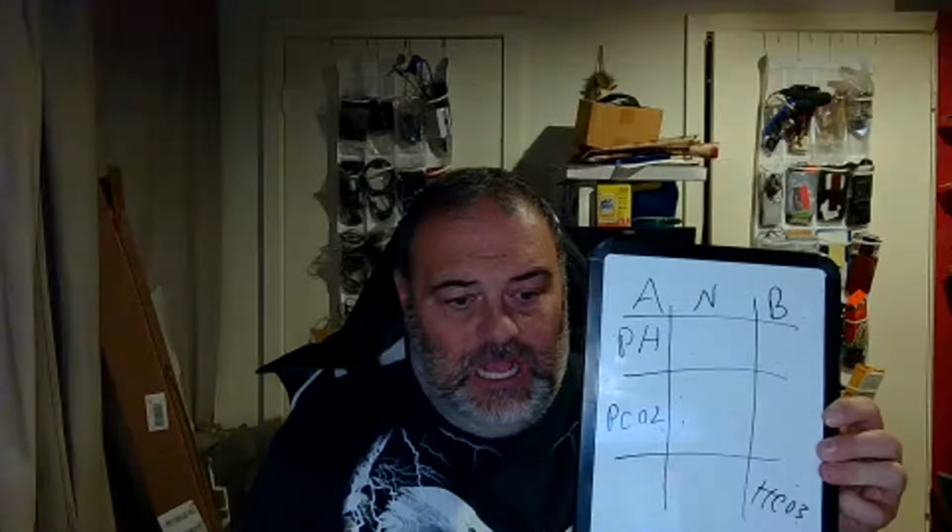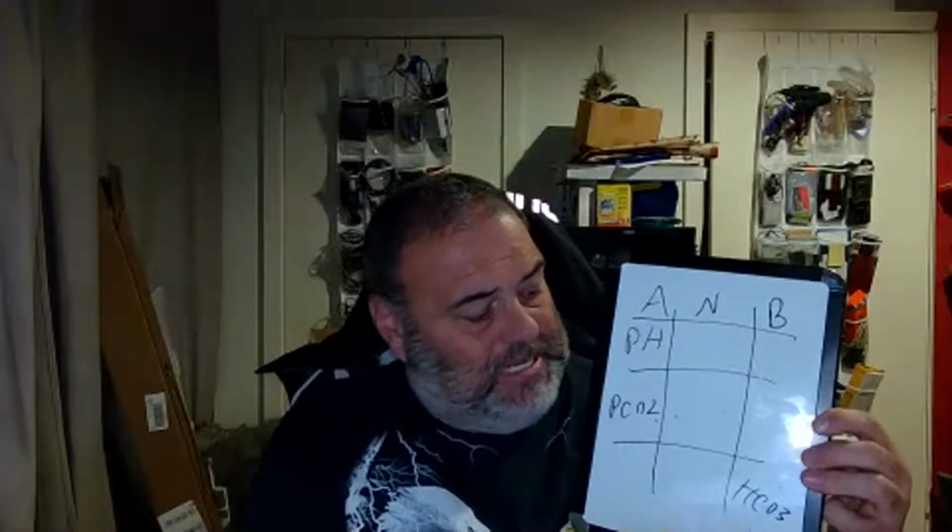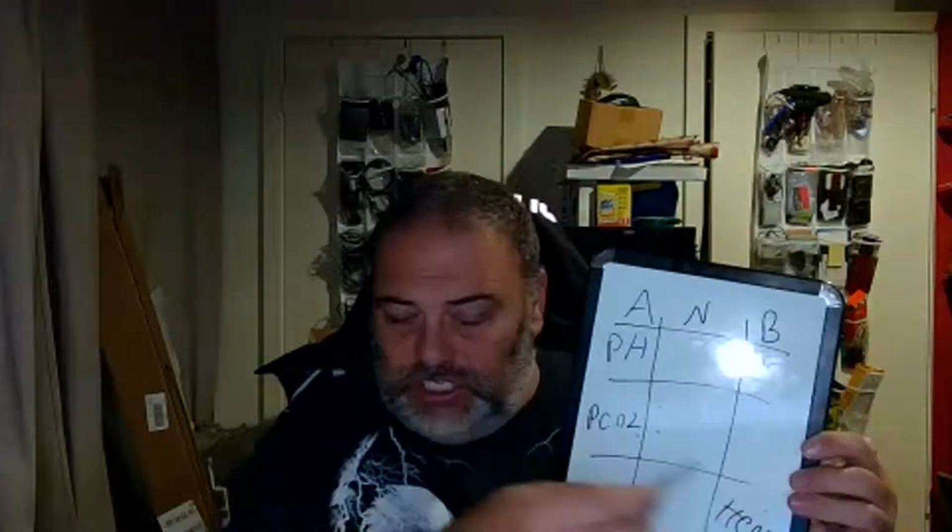And we can see with our bicarb way over here that it's partially compensated. It's being compensated. So the body's trying to fix it. So partially compensated respiratory acidosis. You just read the chart. Write your 3 components down, read the chart. Practice it, and you'll get to where, if you're putting the components in the right place, you won't misread ABGs ever again. It's pretty simple.